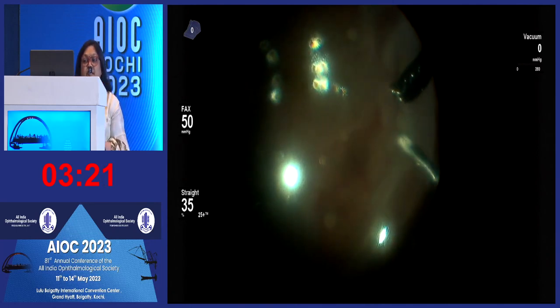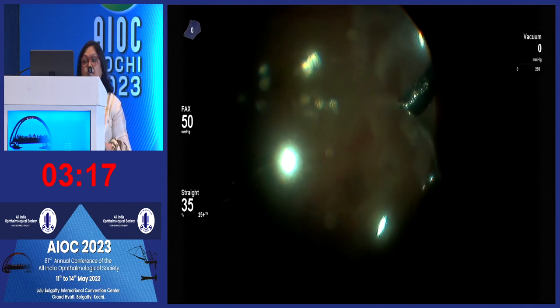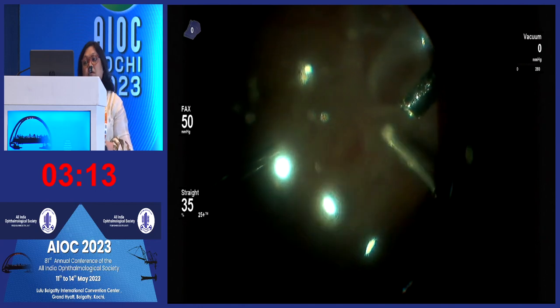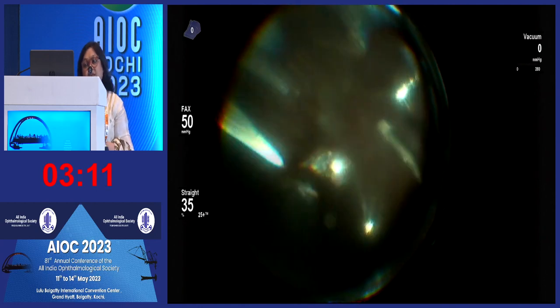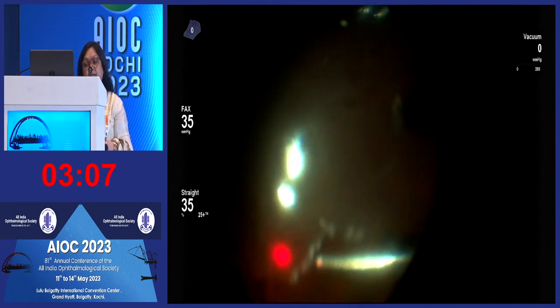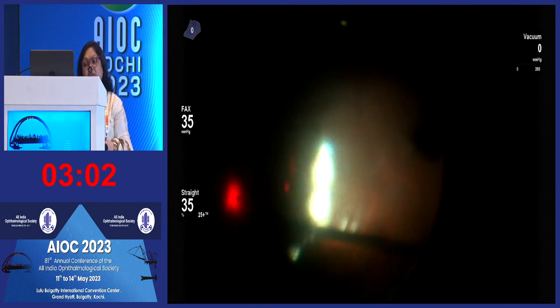You see the edge of the GRT on the temporal side has a lot of intrinsic contraction. So it's flattened with the help of a soft tip with the PFCL in place. The extension at the GRT edges was then lasered, and a small retinectomy was also done at these edges to flatten the retina very well over there.